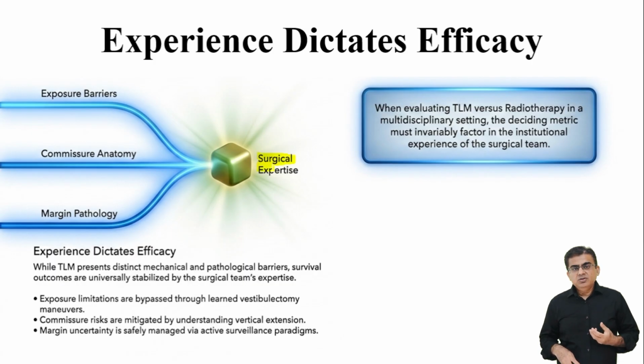When you are sitting in a tumor board, you must choose between laser surgery and radiotherapy. The deciding factor in that room must always be the true institutional experience of your surgical team.